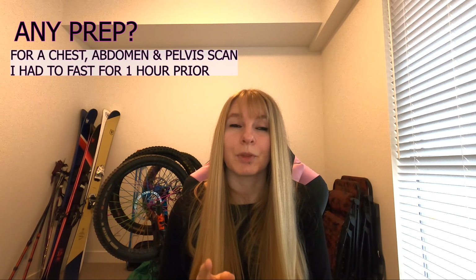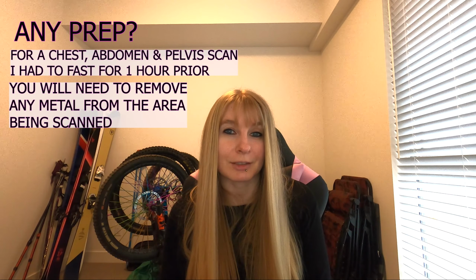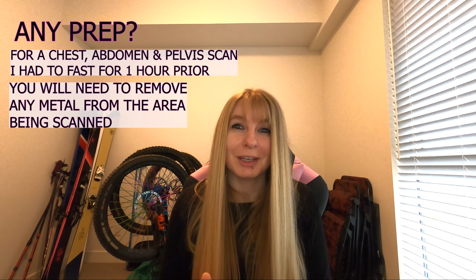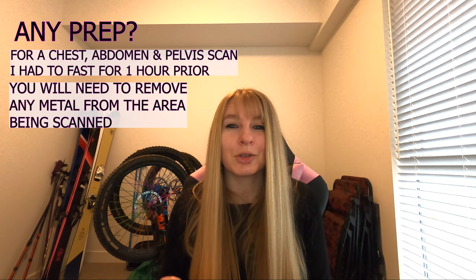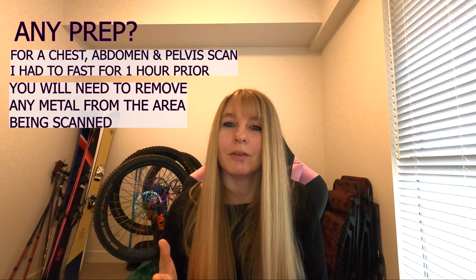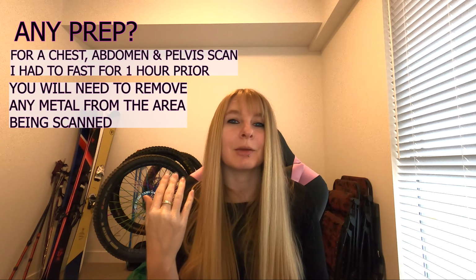But coming on to that, you will need to remove any metal that's in the area being scanned. When I had my head scanned, I had to remove all my piercings, which can be a right old pain, especially if you're not ready for it. I have like 10 between my ears and my lip right now, so make sure you ask about that before you turn up, because I don't know about you, but it takes me a good 10 minutes or so to get everything out.